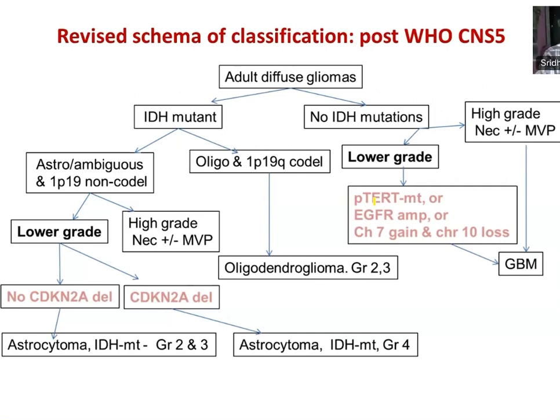You're looking into glioblastoma unless you rule out other markers like histone mutant tumors, G34 mutant tumors. I told you they can also demonstrate ATRX loss. So if IDH wild type is there, and you exclude other alterations like histone, then you can call glioblastoma. There is nothing more signifying on ATRX. First is IDH mutant or not. If IDH mutant, then only the ATRX interpretation comes into the picture.